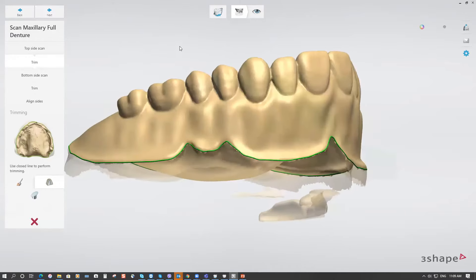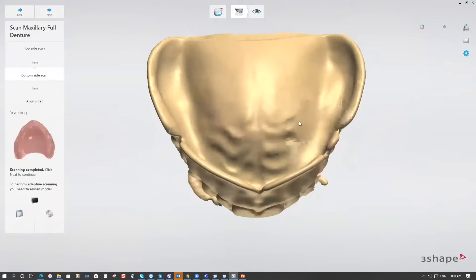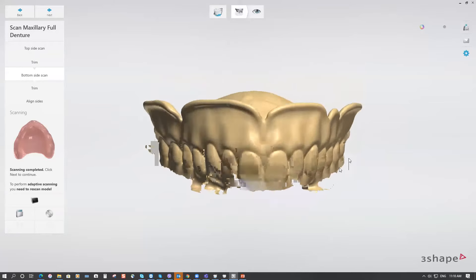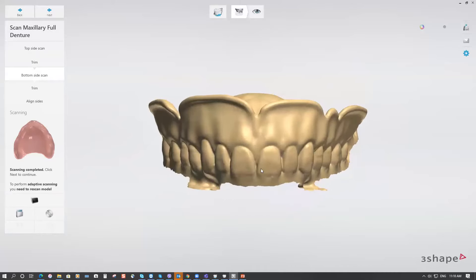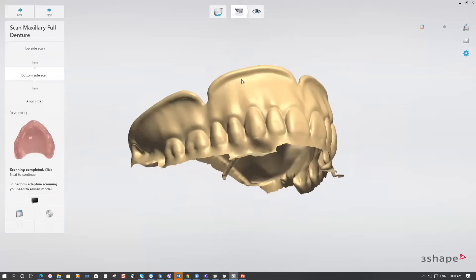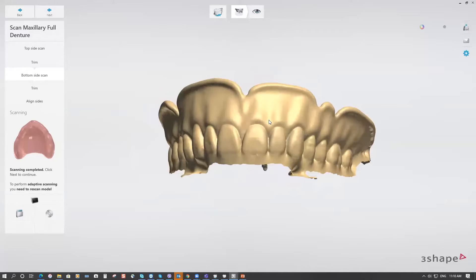After scanning the top of the denture, go to the Trim step and draw the trim line all around the border of the full denture. If you have wash impression material inside the intaglio surface of the denture, scan it as well — you'll then have the option to modify the base and remove any bumps or extra wash material from the base using the Sculpt tool.